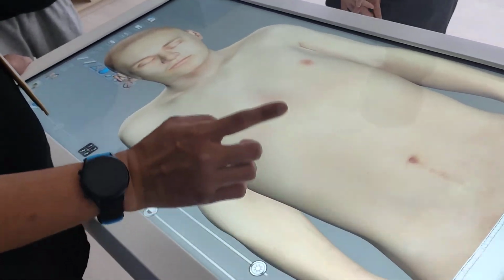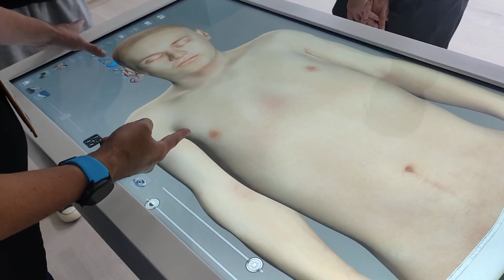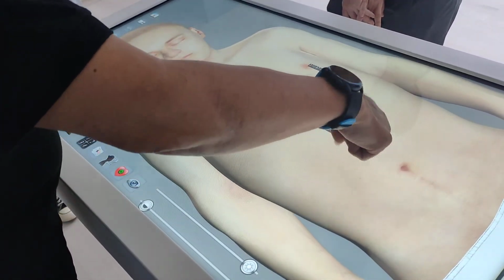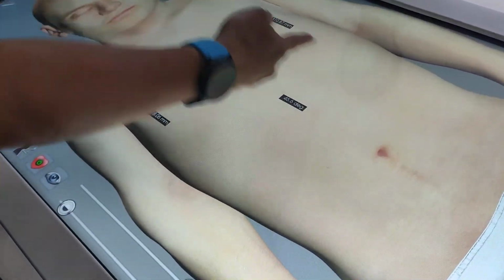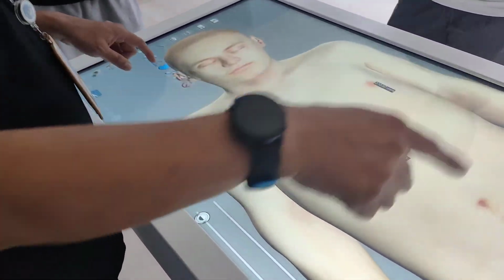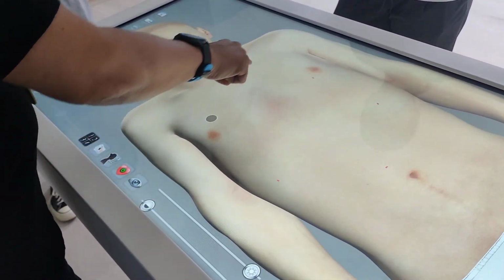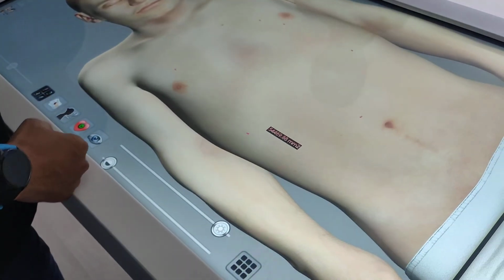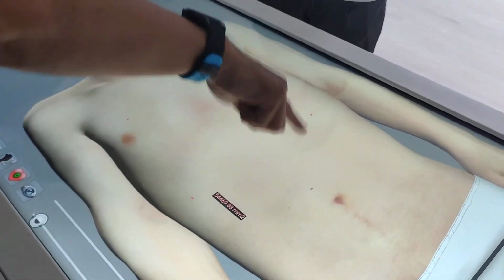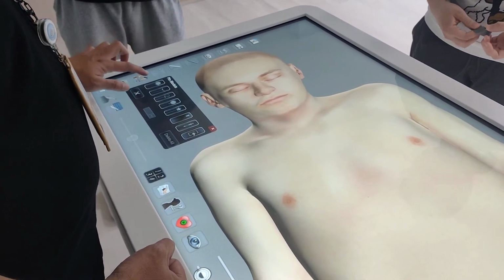And I can also measure the angle. So I want to measure the angle of this. The second one, 0.1, 0.2, 0.3, and this is the angle. 所以这是两角度，刚刚是两长度。And I can also measure the area. Okay, and this is the area of this, the total area of this spotted place.